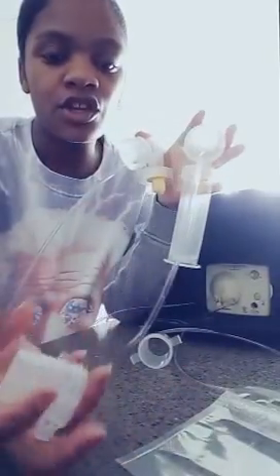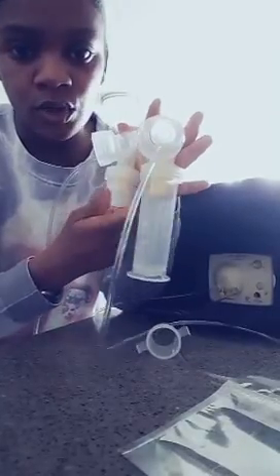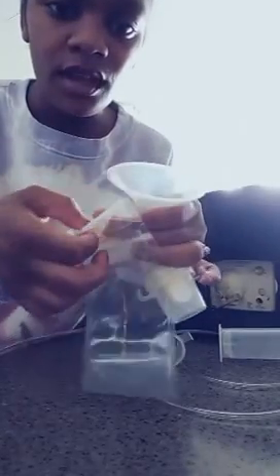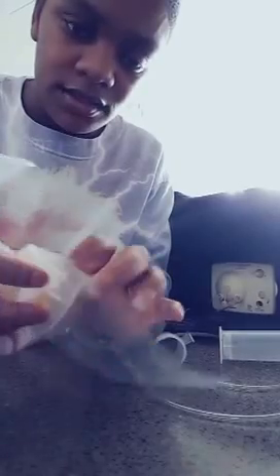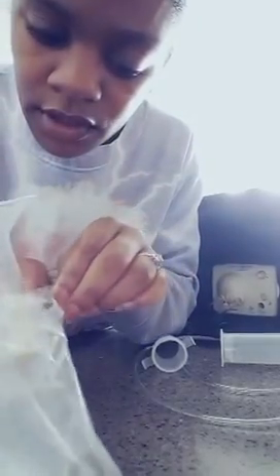If you're going to use the Medela pumping storage bags, then you want to use a connector. So that screws on just like a bottle or a tube. And this connector allows the bag to hang. You see how there's these two hooks here? So that you can hook the bag on. So simply open the bag. Insert the hook into the bag. And then there's little holes right here where you can use the hooks to hang the bag.